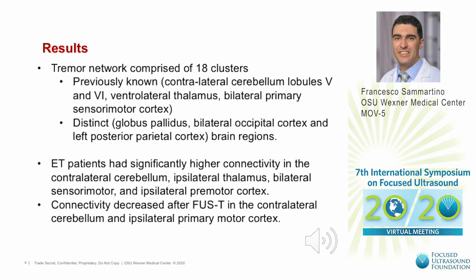Also, the ET patients had significantly higher connectivity in the contralateral cerebellum, ipsilateral thalamus, bilateral sensory motor, and ipsilateral premotor cortex. The connectivity decreased after focused ultrasound in the contralateral cerebellum and ipsilateral motor cortex.